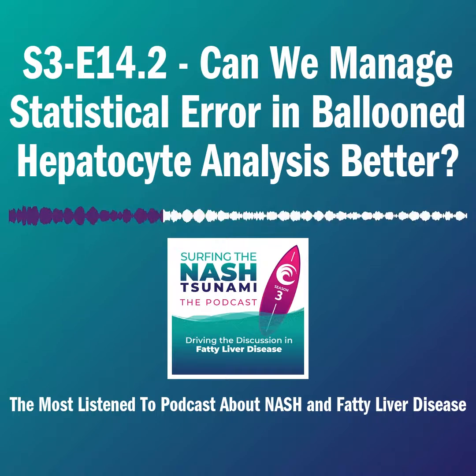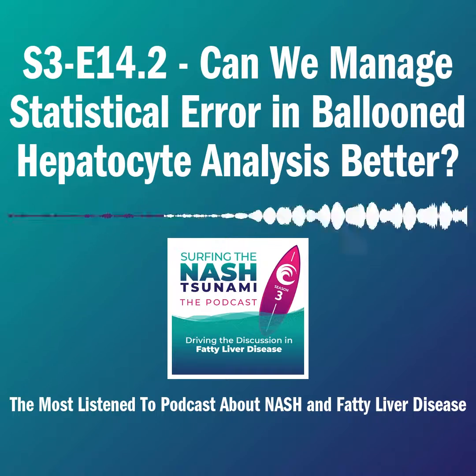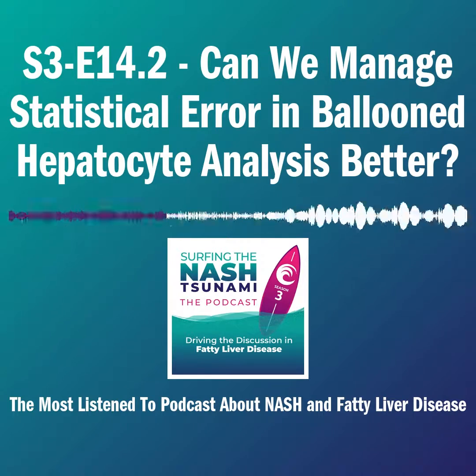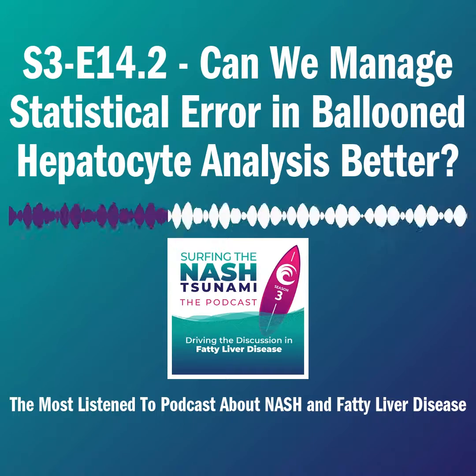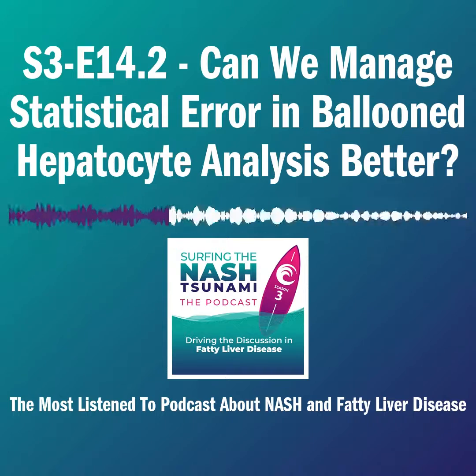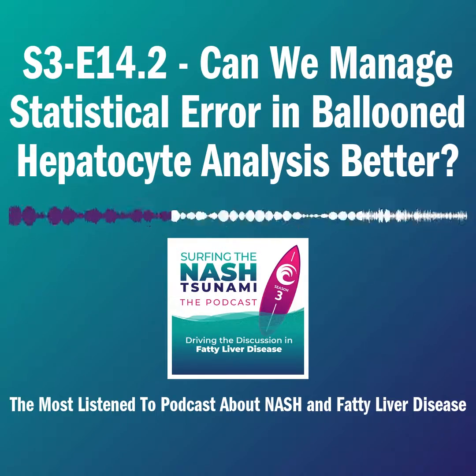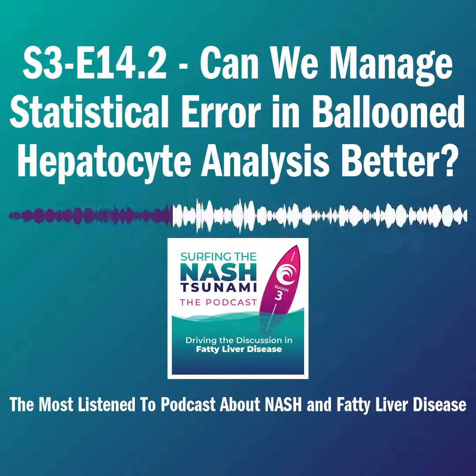The second step may well be that you use a human pathologist to confirm this is fatty liver disease, no, this isn't autoimmune hepatitis, but when you actually want to quantify and to therefore be able to detect change, you hand that over to a machine where quantification can be done in a much more standardized approach.